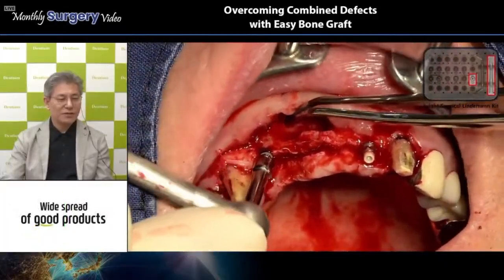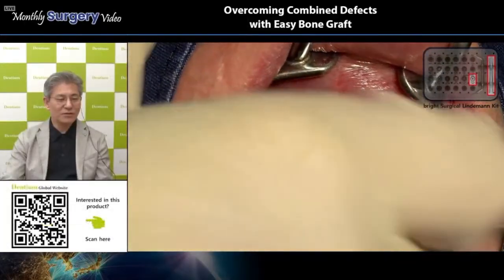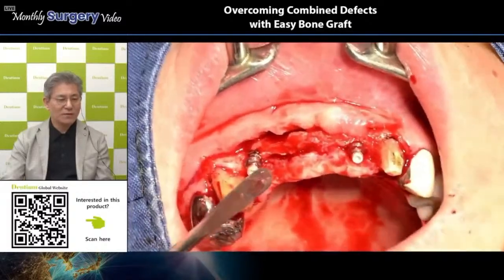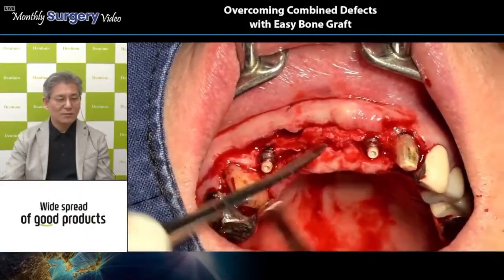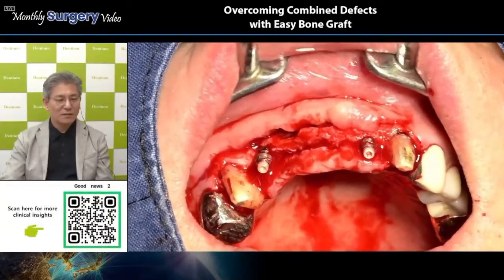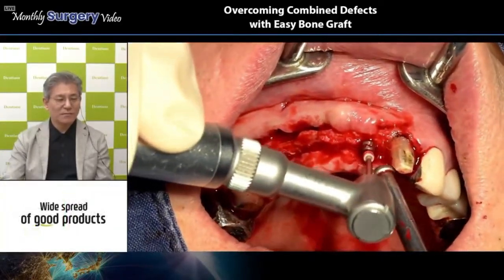Okay, a hand ratchet was applied to make more insertion of this fixture into the osteotomy site and get the proper depth. Good. Actually, at the bottom of this, the angle, the bevel portion, is at the same level as the bone crest.